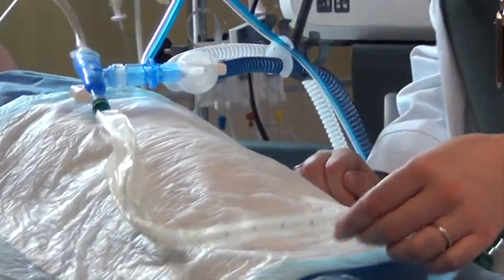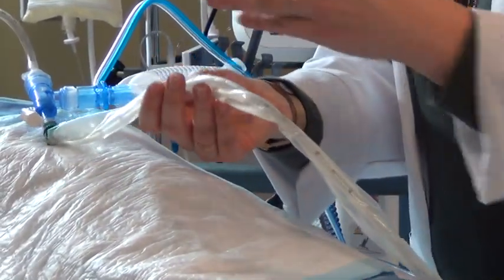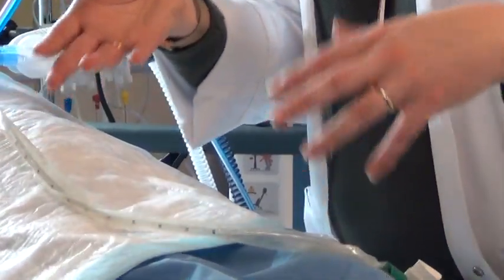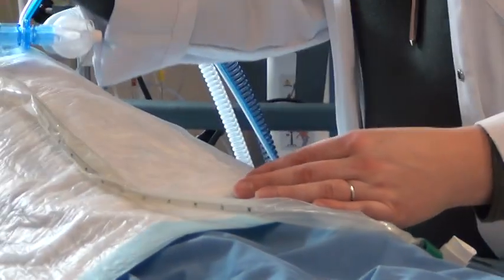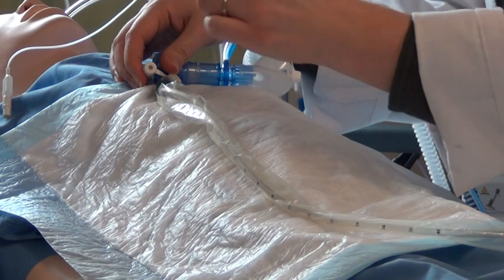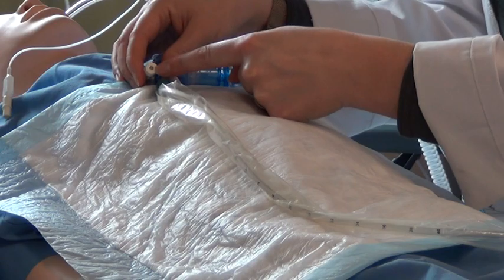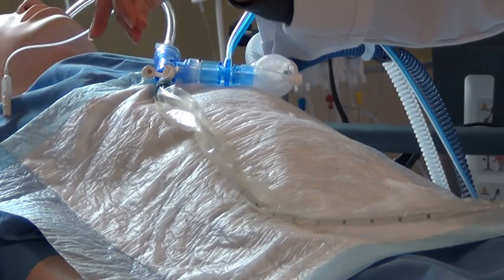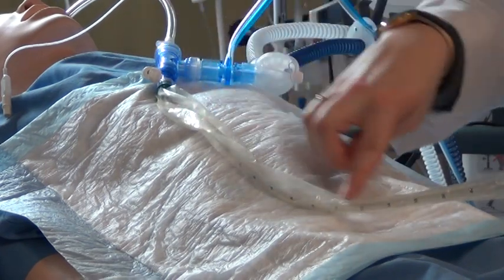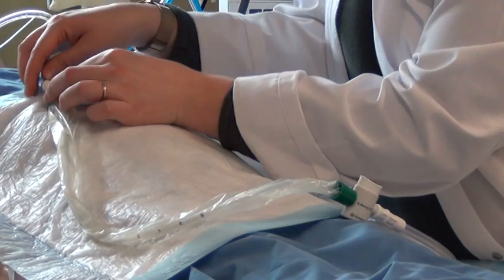If ever for any reason the secretions that are in this tube, I mean, they remain sterile in the sense that the system is sterile, but if we do want to clean out this tubing as it gets sometimes dry and crusty and very thick secretions, there is actually a way to connect a little squirt bottle of normal saline right over here in this hole, and as we squeeze on the bottle, the normal saline will go into our tubing and clean it out. So you may see that happen as well.